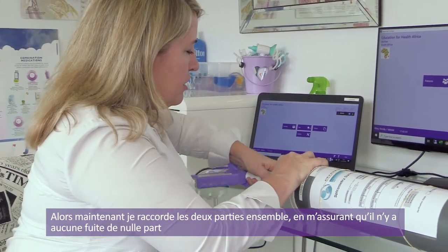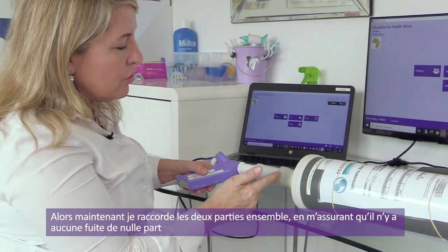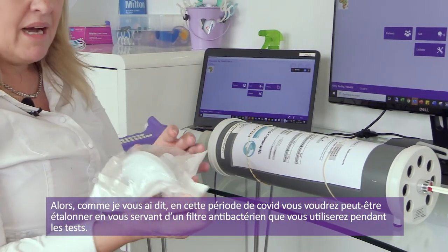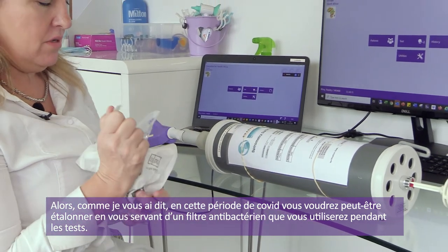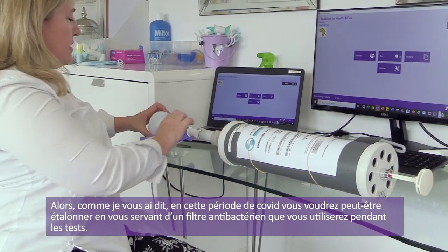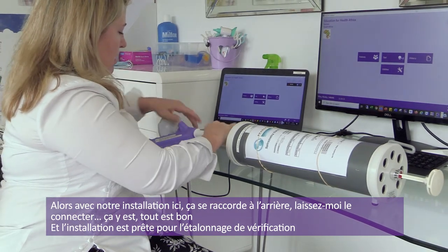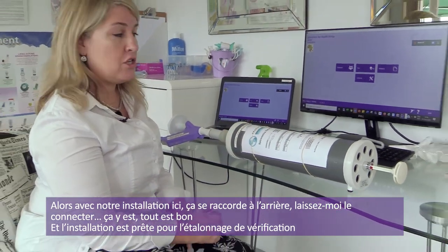Now I'm going to connect it to my syringe, making sure there are no leaks anywhere in the circuit. In the time of COVID, what you might need to do is calibrate using the bacterial filter that you're going to use at the time of testing. In this circuit, it fits on the back here. I now have my circuit ready for the calibration check.